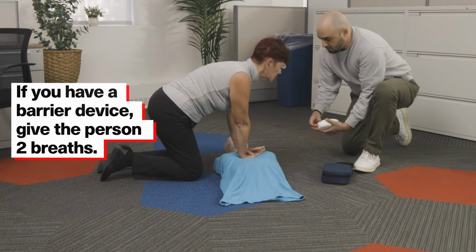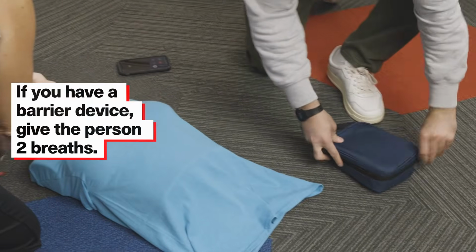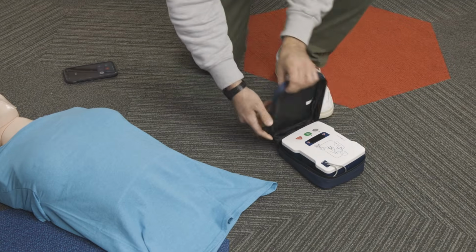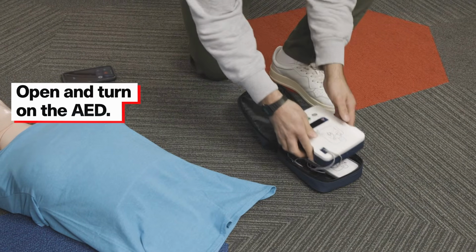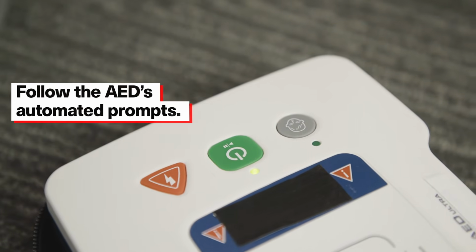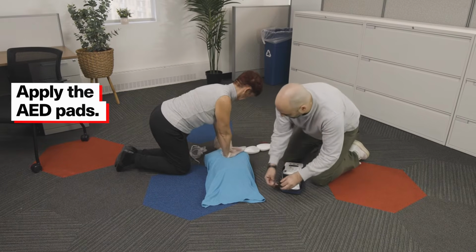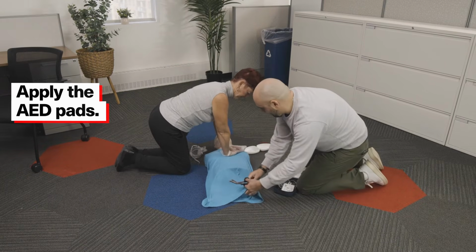If you have a barrier device, give the person 2 breaths. If not, continue doing compressions. When the AED arrives, open and turn on the AED. Follow the AED's automated prompts. Apply the AED pads. Remove any clothing or medical patches that could get in the way.